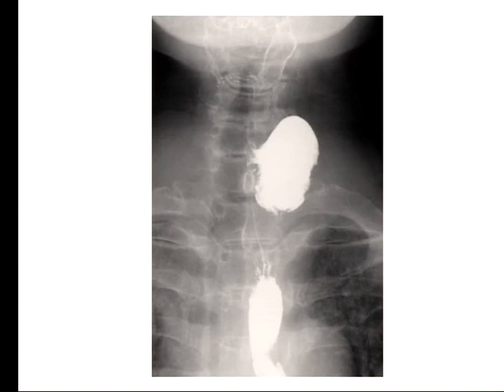In patients with diverticulum of the esophagus, you can easily go in and out of the esophagus with fluoro, unless we ask the patient to swallow barium like this. We don't do this. So on the left side, the esophagus is really vulnerable to injury.